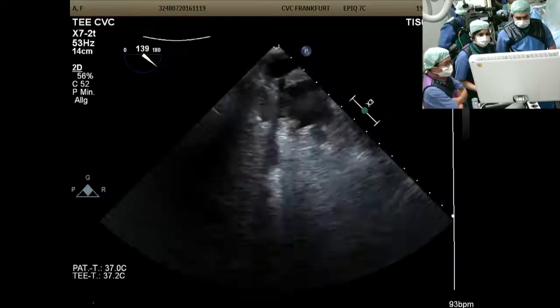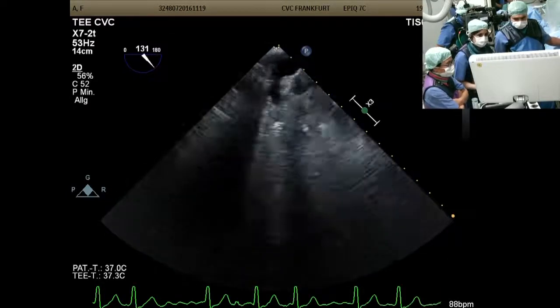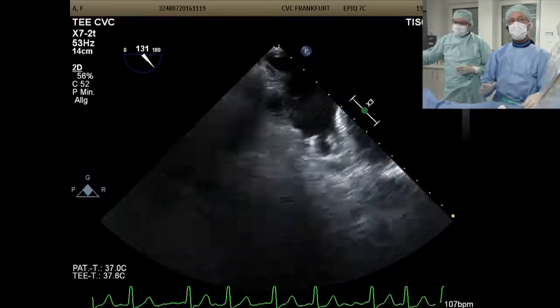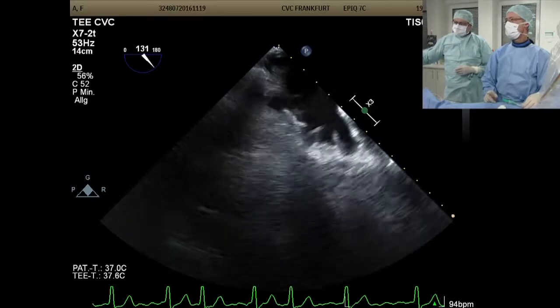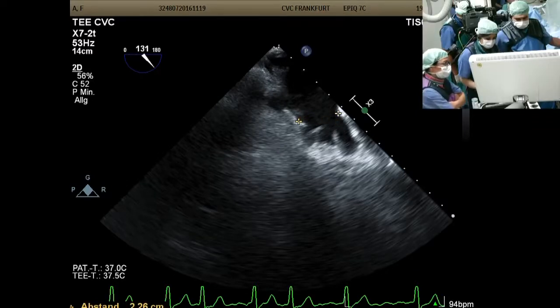Okay. Yeah. So can you measure the length of the functional landing zone, which means from the level of the circumflex to this ridge, which is dividing the appendage into 2? Yeah, this is the important image here. Okay. So Horst, do you mean that 3 or 2 ridges here? Here to there? Yeah. Looks like 3 there. 23 millimeters we're getting. Yes, there are 3 small lobes there, that's right. You can see them here. I'll just point them out. Anterior here, and then middle and posterior.